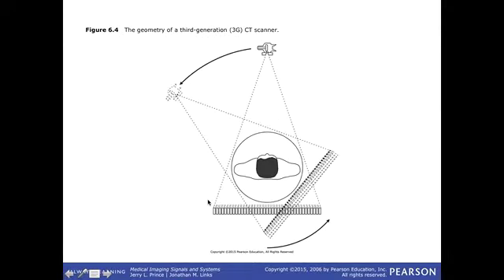And then we get to pretty well where we are today, which is I'm going to put detectors all the way along so that I can image the entire field of view in one shot, right? Or a projection of that whole field of view just in one go. So if I go poof and take my X-rays, then I'll collect them here and I've got that projection. I don't have to raster the machine around.